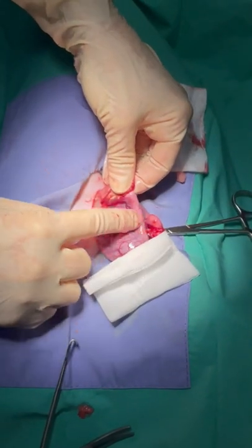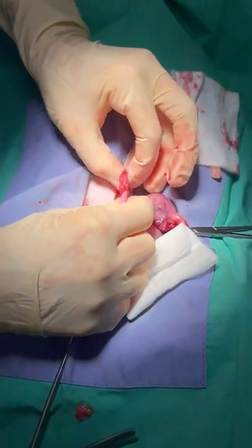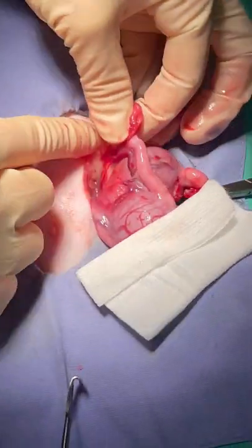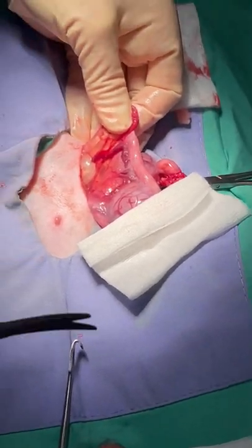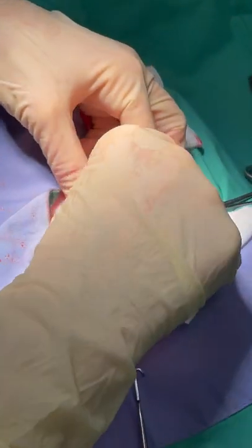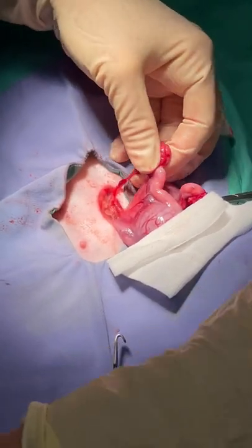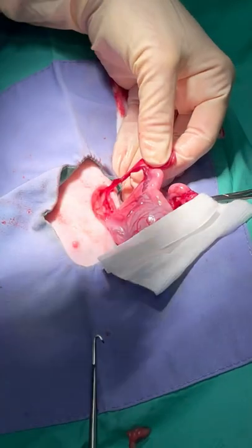I've separated out the horn, the blood vessels, and the suspensory ligament, and I'm actually holding the ovary in my hand. That's the proper ligament right here. You can put a clamp on the proper ligament and use that as a way, but for me, this works out best. Now I'm going to cut the suspensory ligament — it's the same exact procedure whether they're pregnant or not. The vessels are just bigger, typically, when they're pregnant. I'm going to make a hole in the broad ligament, very gently holding these blood vessels because they're fragile — if I pull too hard, they're going to tear.